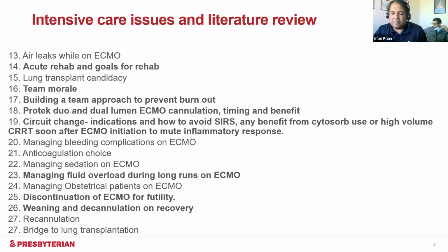Managing bleeding complications on ECMO, obviously this is not fun, but you have to do that. It's an unnecessary annoyance. And this is something that more and more centers are shying away from aggressive anticoagulation and cutting back on that, and more so in VA cases. So again, that's something that we need to discuss. And then anticoagulation choices, we've come a long way from just straight heparin, using just ACTs, to more specific measures of measuring anticoagulation. There have been bivalirudin protocols, kind of back and forth between heparin and bivalirudin, and other choices out there.